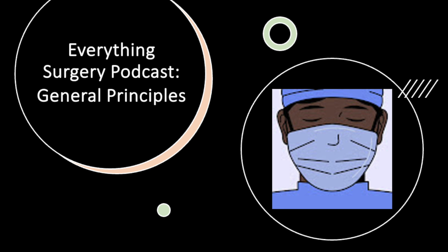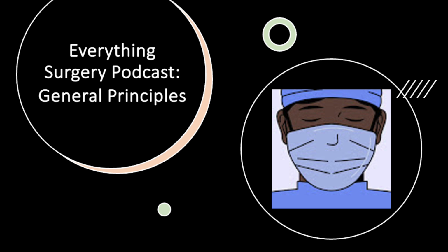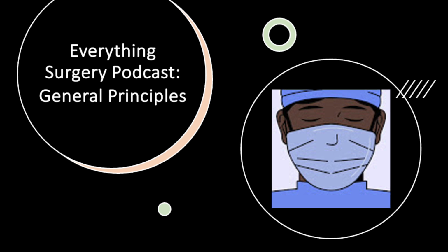Step 7. ST segment. Early ventricular repolarization. The ST segment is crucial for detecting ischemia or infarction. Normally, it is flat and aligns with the baseline. Elevation of the ST segment is a key sign of acute myocardial injury or ST elevation myocardial infarction and must be observed in specific territorial patterns, such as inferior or anterior leads. It can also be seen globally in pericarditis or in benign early repolarization. Depression of the ST segment indicates ischemia or strain, and may be horizontal, downsloping, or upsloping.